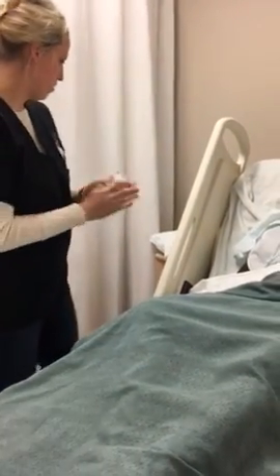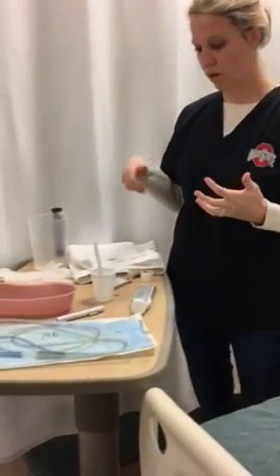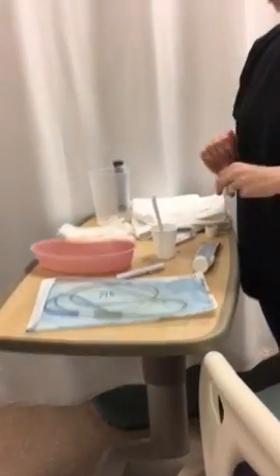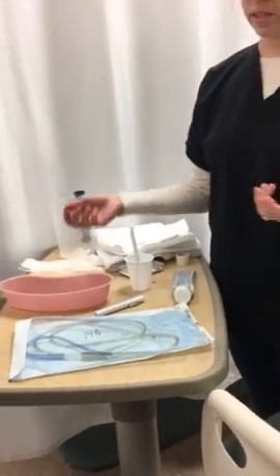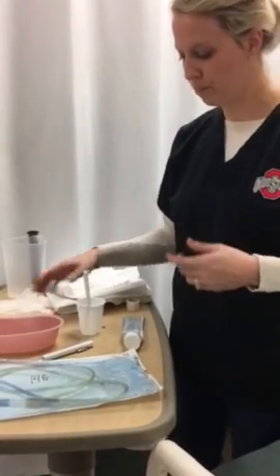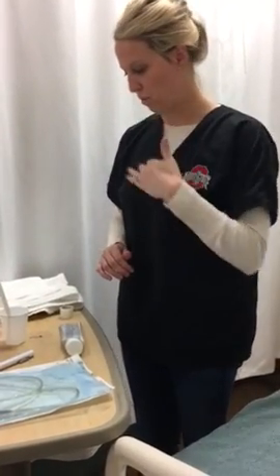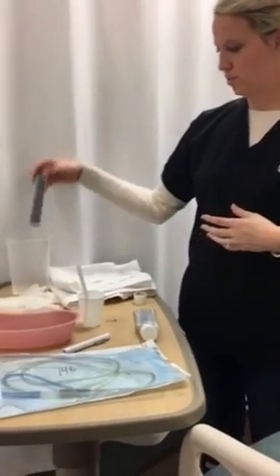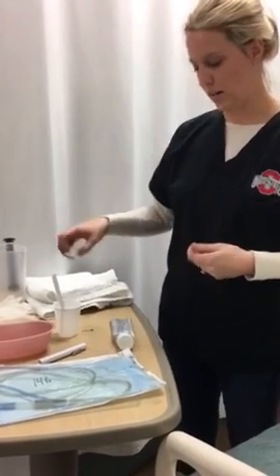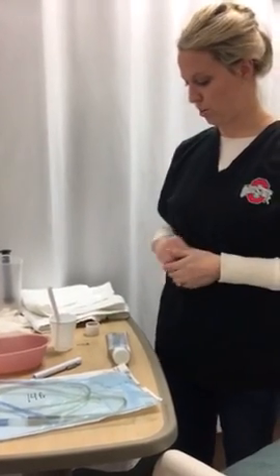Okay. So now it's time for the actual procedure. So I have my equipment here. I have our tubing. I have lubrication. I also have an emesis basin, which I'm just going to put the gastric contents in and test with my pH paper. I have a cup of water for the patient, and that can help with swallowing once I start the placement. I also have a syringe, and that's how I'm going to check the placement, and then also marking tape to mark the tube and also secure it to the nose.